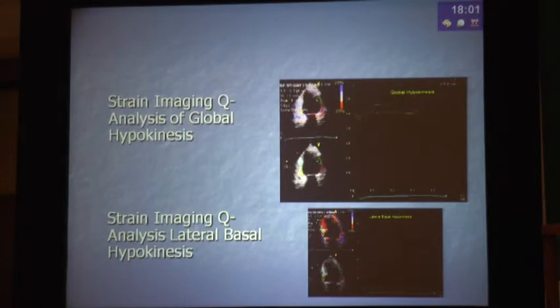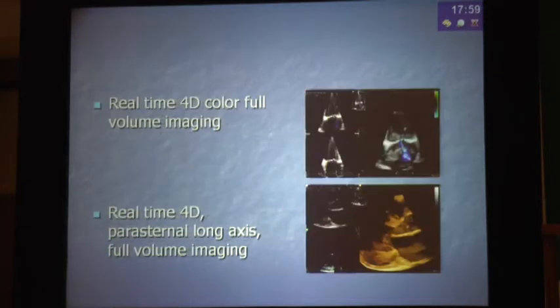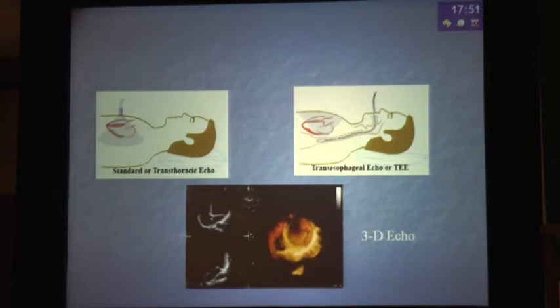Further, a few advancements in the field of echocardiogram. 4D is also coming, but really not taking off compared to the previous modalities. So, like I said earlier, this is a transthoracic echo, in which we place a probe on the chest wall, and the other is transesophageal, in which we put a transesophageal probe like an endoscope and take views of the heart from the esophagus.